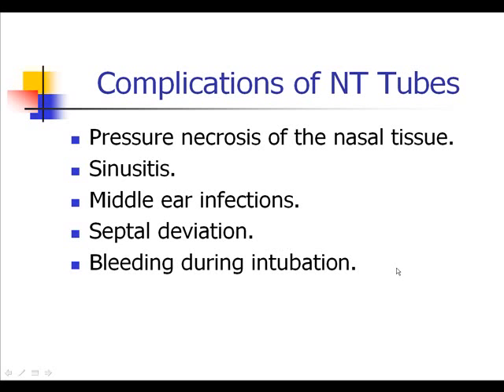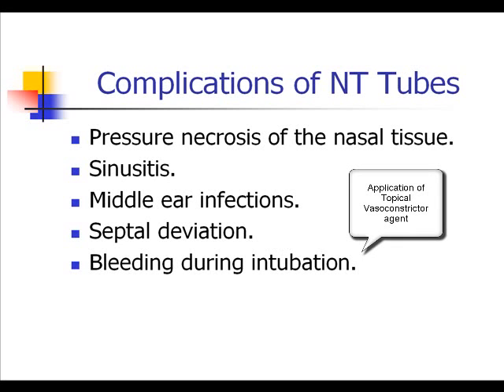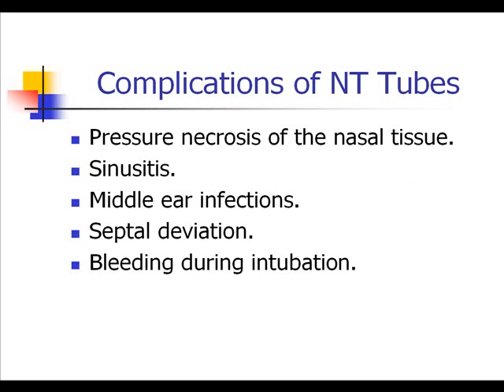Another step that you should utilize if you are planning on doing a nasotracheal intubation is to apply some kind of topical vasoconstrictor in order to open up the airway and prevent mucosal damage. At one time, cocaine was used as a vasoconstrictor, and it's an excellent vasoconstrictor, but it's often very difficult to obtain legally in many countries, and so certain types of xylocaines or lidocaine preparations are preferred prior to the nasal intubation.